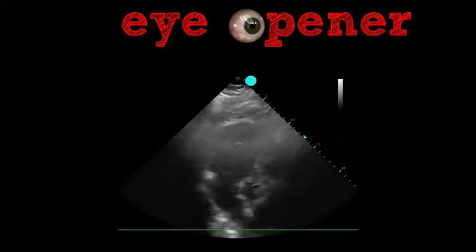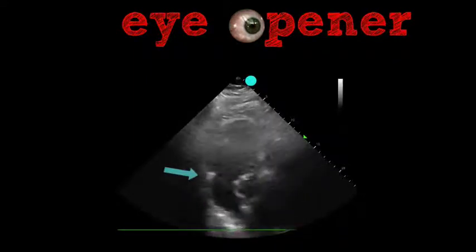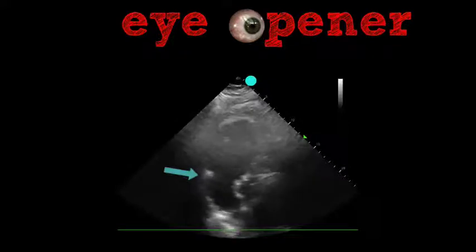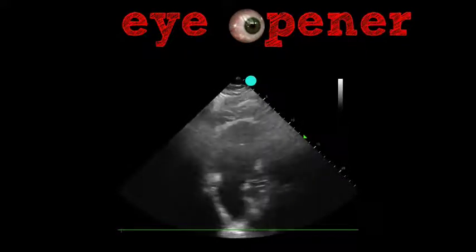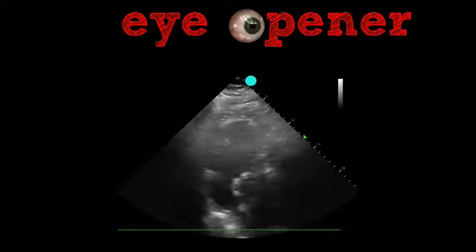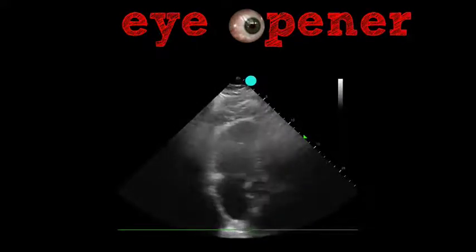And then we notice that along the tricuspid annulus, we really don't see much motion back and forth with contraction and relaxation. That's a measurement we call TAPSE, or tricuspid annular plane systolic excursion, which is a mouthful and a complicated term for an easy concept.